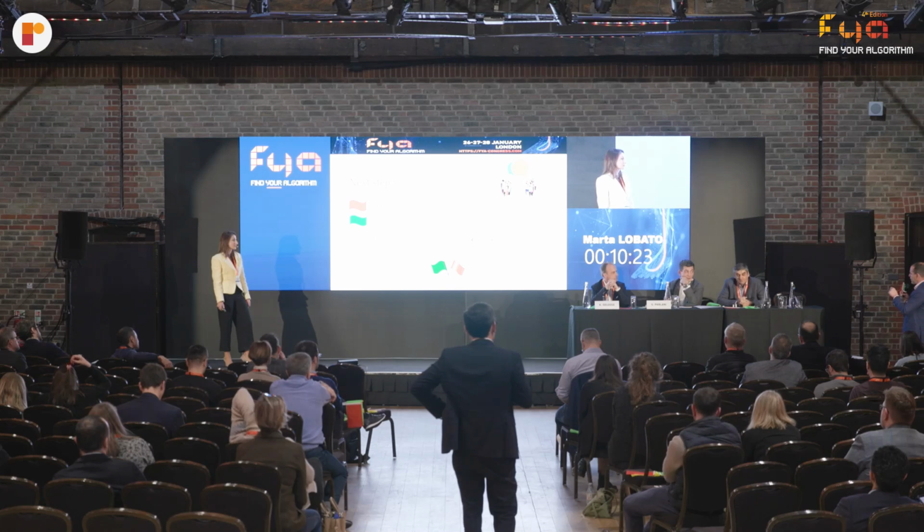I may use it, depending on how the result looks at the end, after finishing the atherectomy, only during the balloon angioplasty, in order to protect from that side. And my question, the vessels are not that small to use a filter device, in my opinion. This is the approach at least I and a few of my colleagues in the department take on this small vessel disease. And Thanos, where would you put the filter in this case?